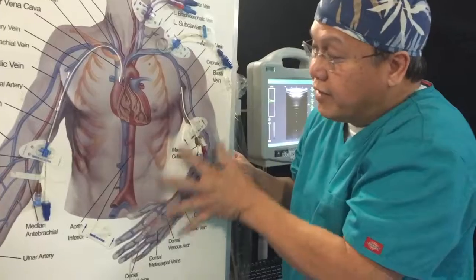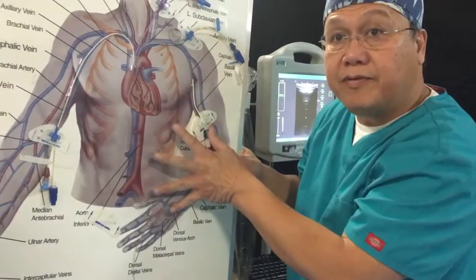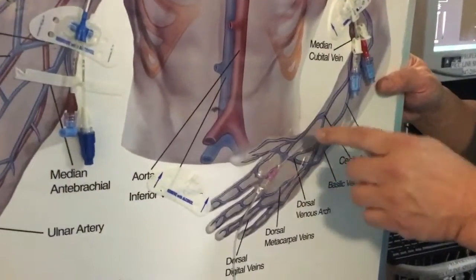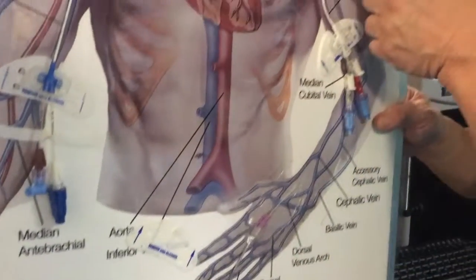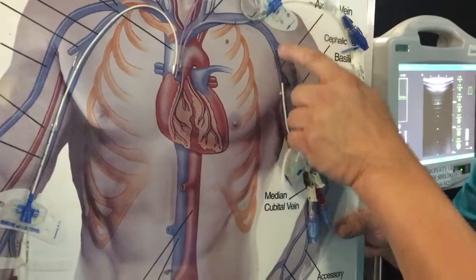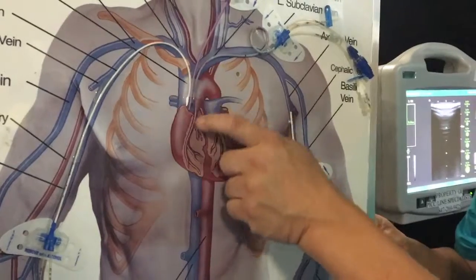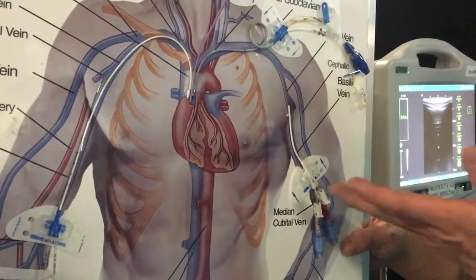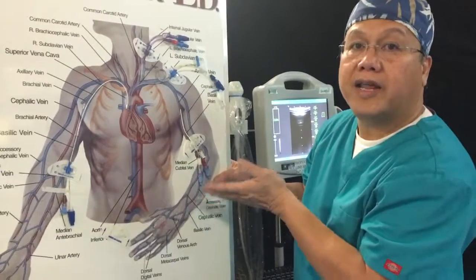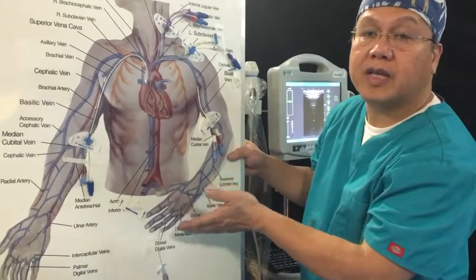The other two catheters that I presented earlier are what we call peripheral IVs. Why peripheral IVs? Because the catheter ends on a peripheral vein. On the arm, it ends on the peripheral vein. On the midline, it ends still on a peripheral vein, because the central vein starts from the axillary, subclavian, innominate, and superior vena cava. So those are the basic vascular access you see on a regular general surgical floor or intensive care unit of a hospital.